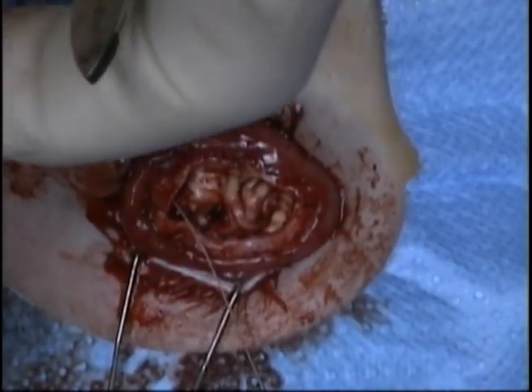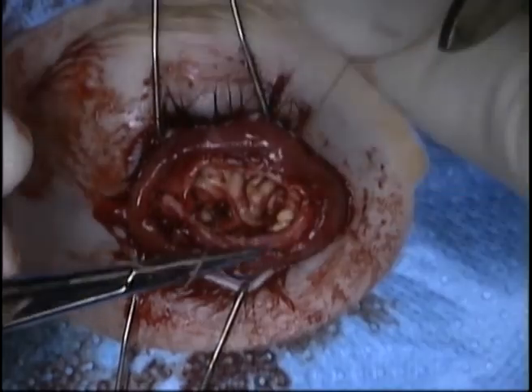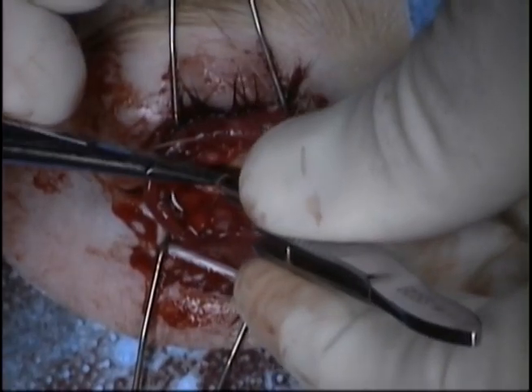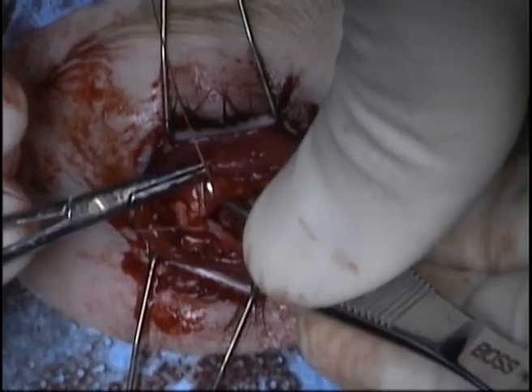In this case, the inferior sclera is imbricated over the superior sclera. This is performed with a running mattress suture so that the two edges are imbricated over each other. This results in two layers of sclera over the implant.